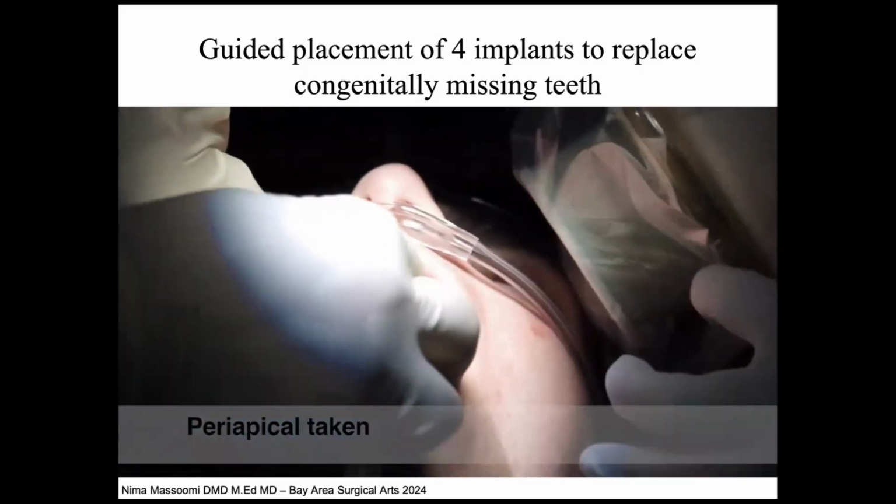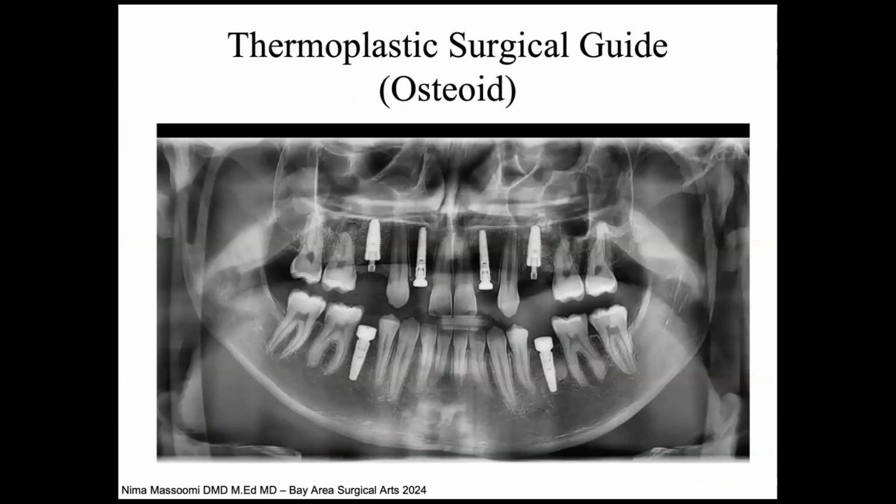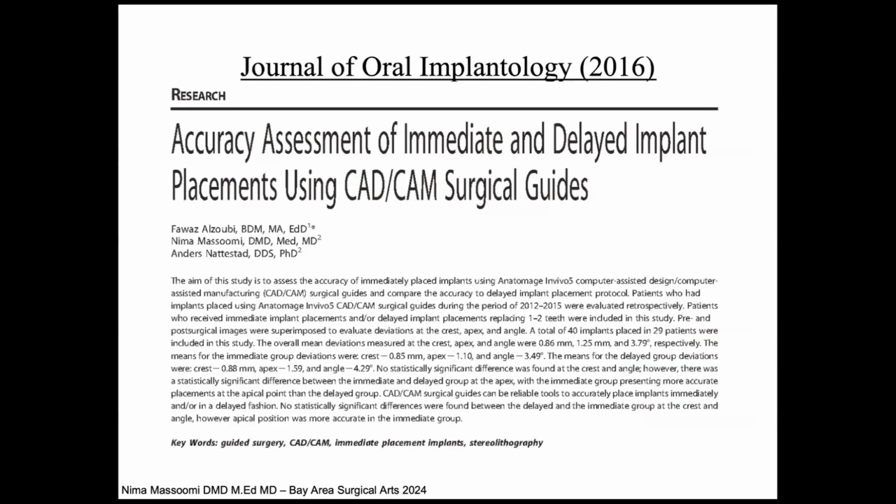And we always take x-rays. This is another point I wanted to make: please, please, please make sure you are taking x-rays. We take x-rays during surgery and immediately afterwards. You won't believe the number of times you put something on an implant you think is fully seated, and you take an x-ray, and oh my God, it's not, right? So always, always take x-rays. This is his x-ray from after surgery, showing that everything's fully seated. Then we're going to wait 4-6 months, and he's going to be sent off to the prosthodontist to start working on finishing this case.